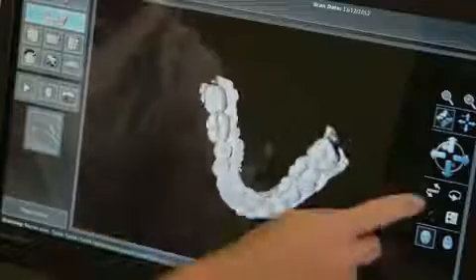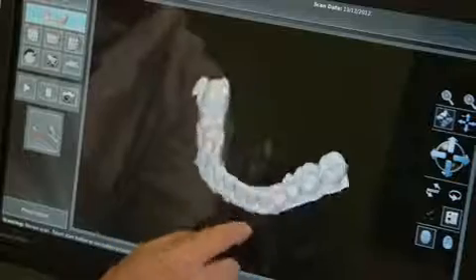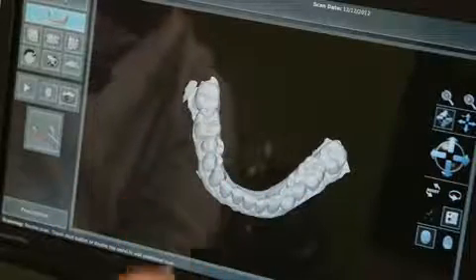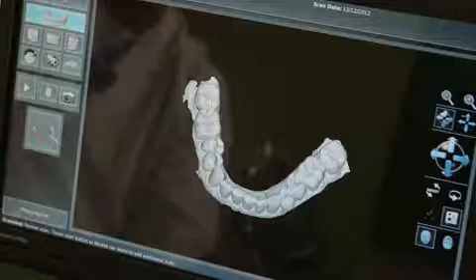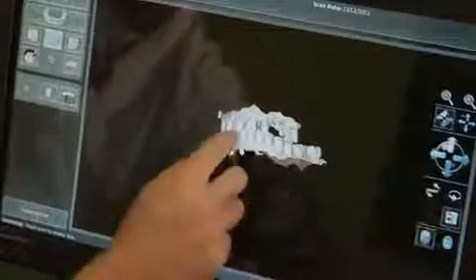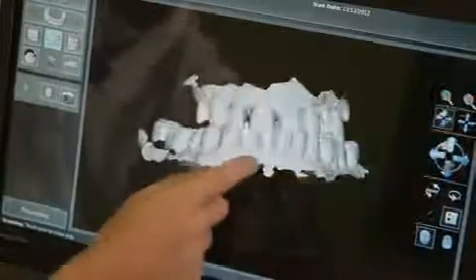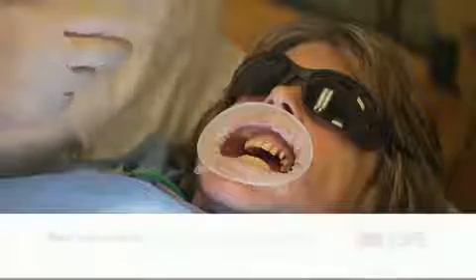On the lower scan, we just wanted to capture all the occlusion and anterior teeth, and we did that in a shorter amount of time because there are no margins to worry about. Articulated, this is what the model looks like, and this will be sent off today with a prescription for the restorations that we want to do.